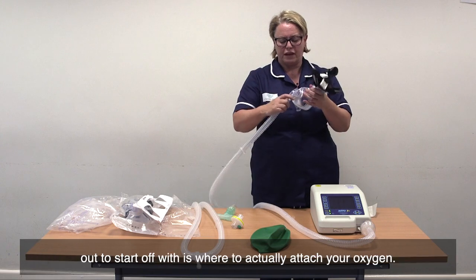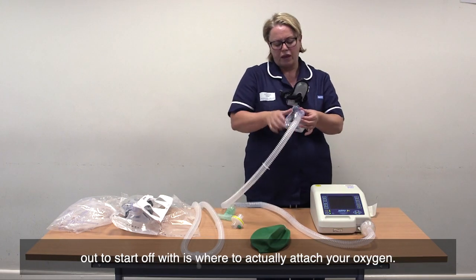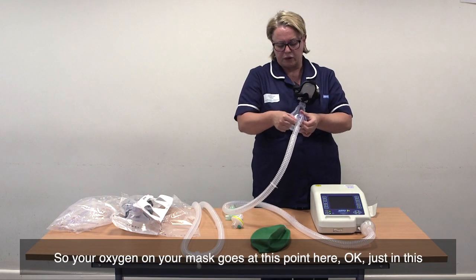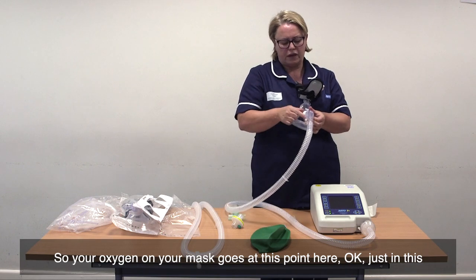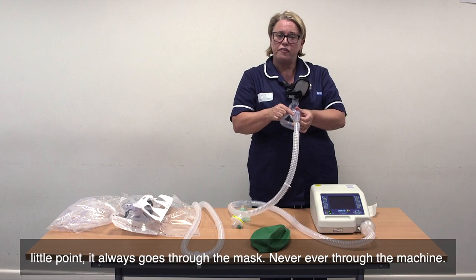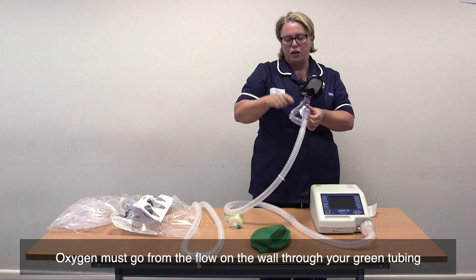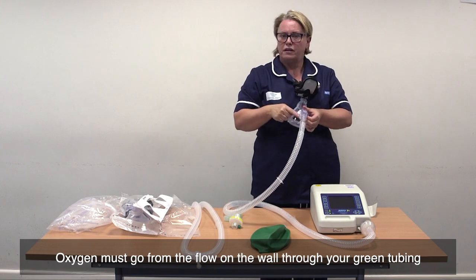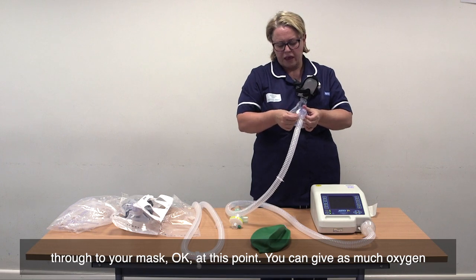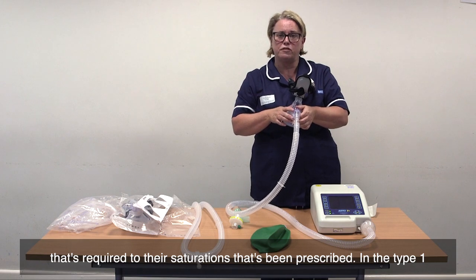What I would like to point out is where to actually attach your oxygen. Your oxygen on your mask goes at this point here, just in this little point — it always goes through the mask, never, ever through the machine. Oxygen must go from the flow on the wall, through your green tubing, through to your mask at this point. You can give as much oxygen as required to meet the saturations that have been prescribed.